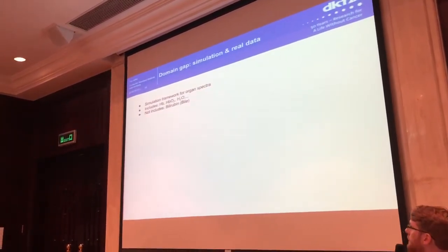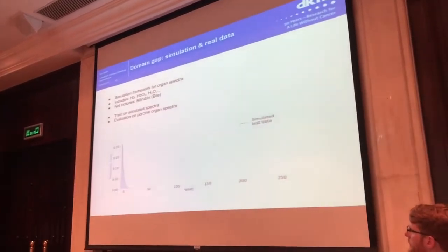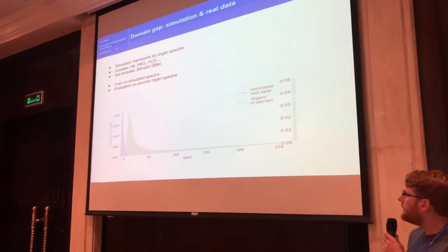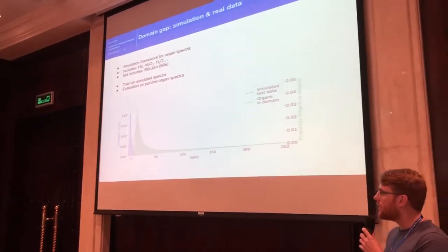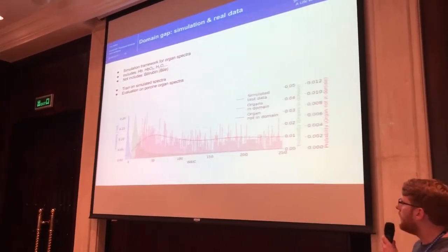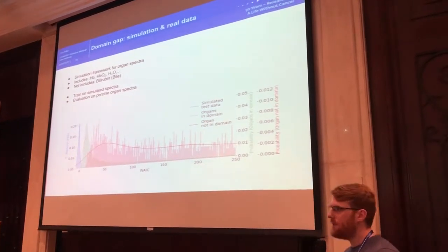Yeah, and so here are basically the results. So we trained on the simulated spectra, evaluated on the porcine organs. So this is the WAIC histogram for the simulated test spectra. This is the histogram for good pig organs, so organs that we should be able to deal with. And here are the ones for the gallbladder, which we are not able to deal with. And there are two key observations here.